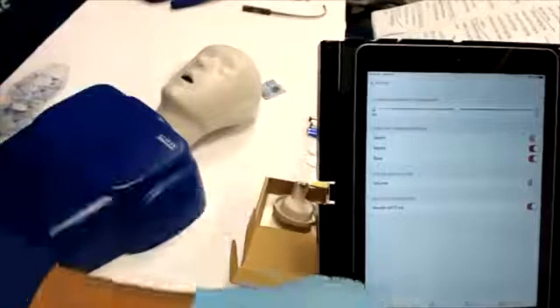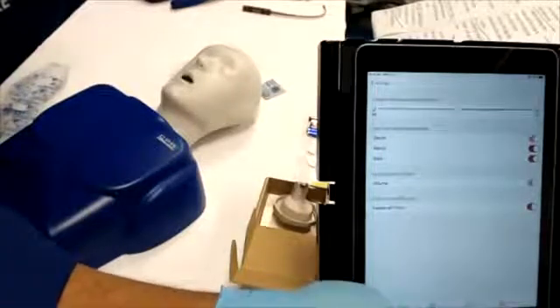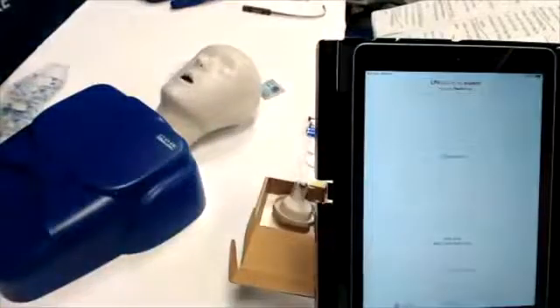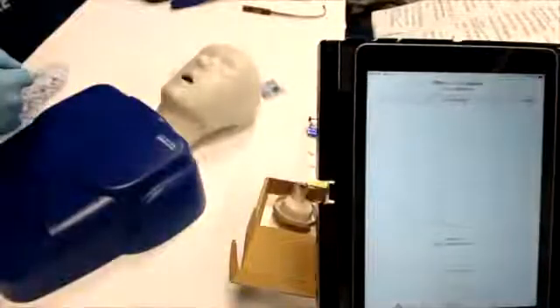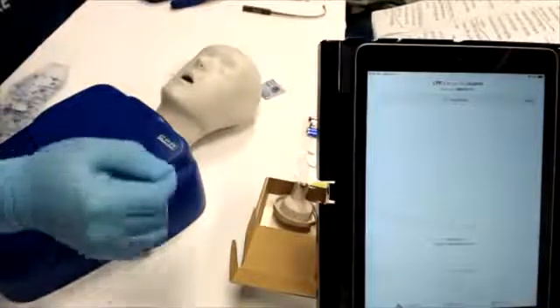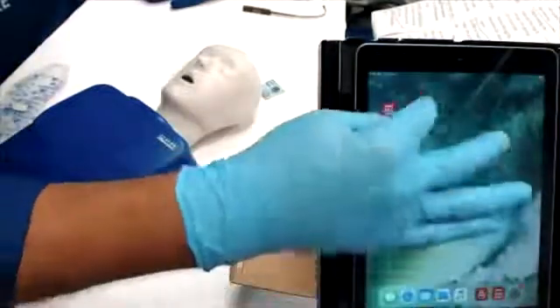Excellent. At this time, we will switch to show you the student application. The student app closely resembles the instructor app. Students first will need to connect their kit in the same manner as the instructor by tapping Connect Kit and selecting their specific mannequin. Again, mannequins need to have batteries in and electronic components powered on.